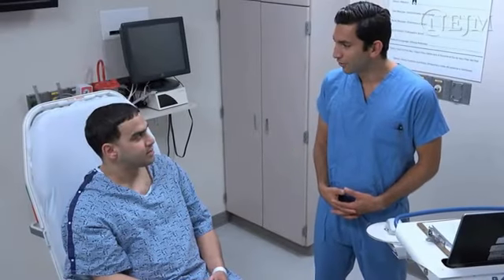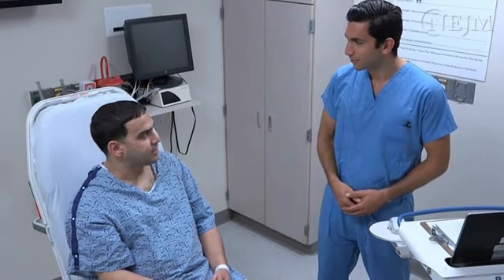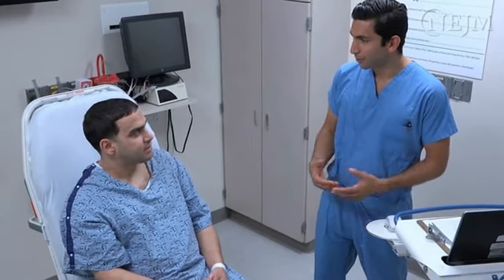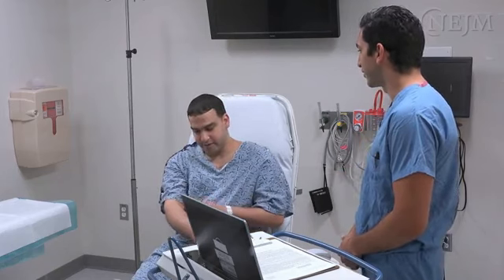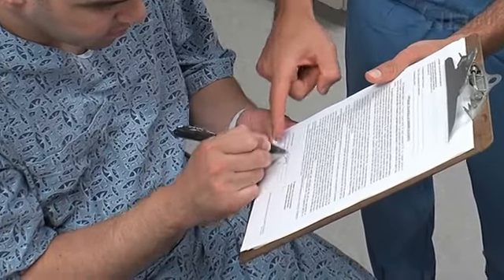The specific licensed practitioners authorized to order a blood transfusion or to perform the procedure may vary with local guidelines. Before you order the blood, explain to the patient the reason for the blood transfusion and the benefits and risks associated with the procedure. Then, obtain the patient's written consent.